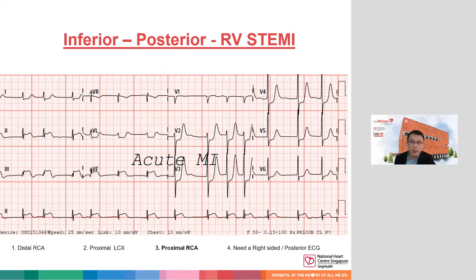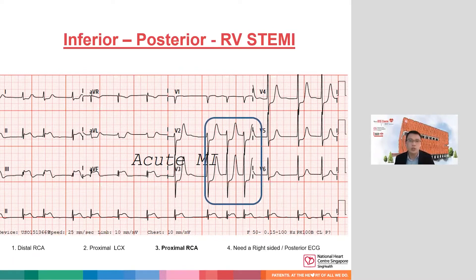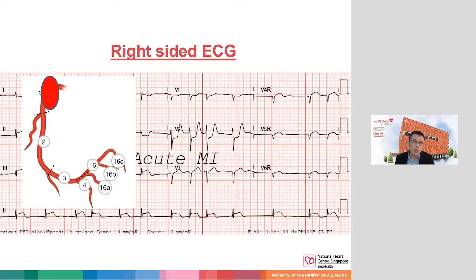Moving to lead 1, you'll notice it is isoelectric, or there may even be a slight ST elevation in V1. This is suggestive — even without a right-sided ECG — that this patient likely has a right ventricular ST elevation MI. Looking at leads 2 and 3, the ST elevation in lead 3 is higher than in lead 2. I think of lead 3 as looking closer to the right side, and based on all these features the likely occlusion is in the proximal RCA. A right-sided ECG confirms the RV infarct.